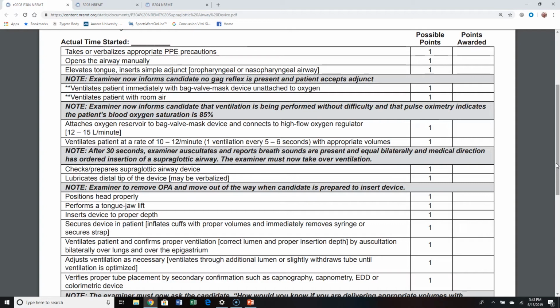This can be anything from a manual maneuver with something like a tongue blade to the maneuver that I jokingly refer to as the big mouth bass option, where you stick your hand into the mouth, pinch the tongue down to the floor of the mouth with your thumb and forefinger, and kind of lift up and away so that you can get that tube inward.